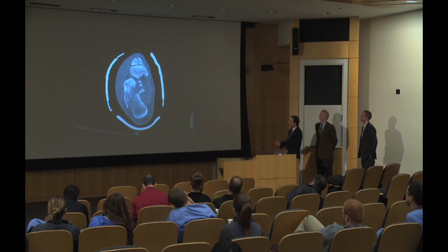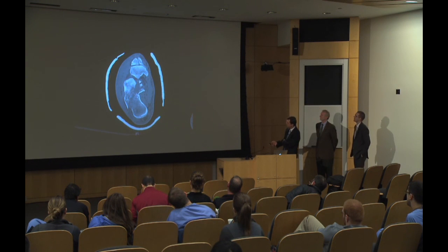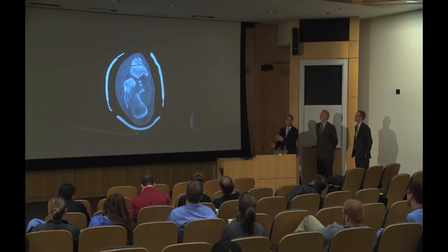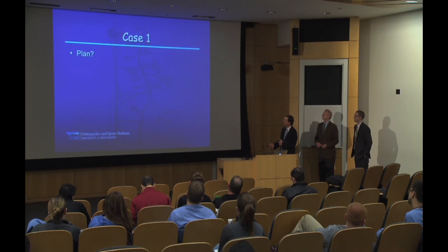The one caveat is if you look here on the axial projection, the varus of the tuberosity does not get better. It only gets worse over time. So you have to recognize that the tuberosity needs to be controlled. But really in this injury, it's this component of the injury that needs to be compressed to the sustentaculum, and this is what we did.